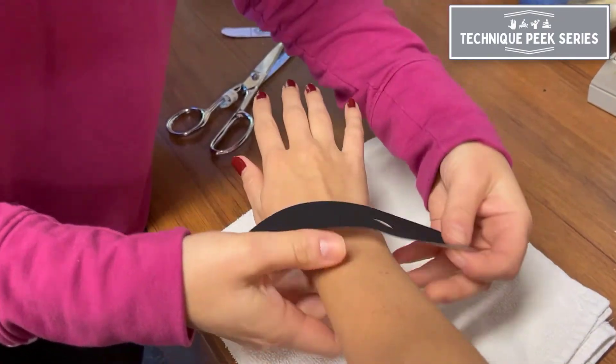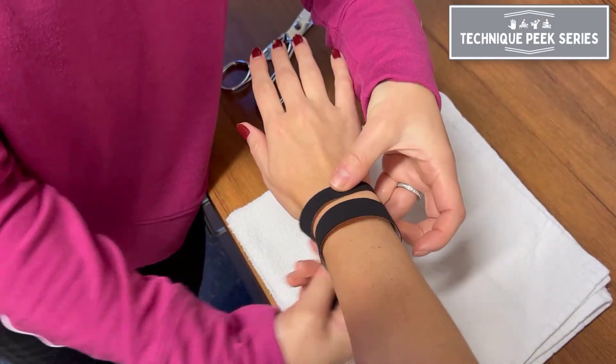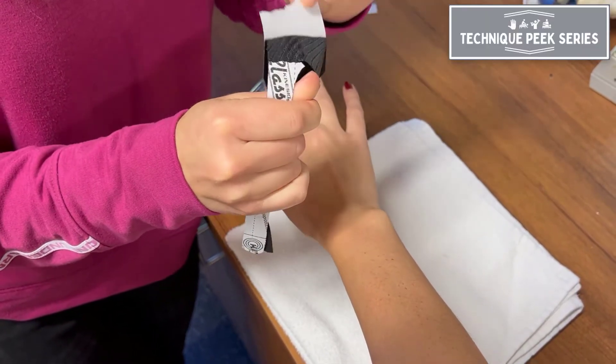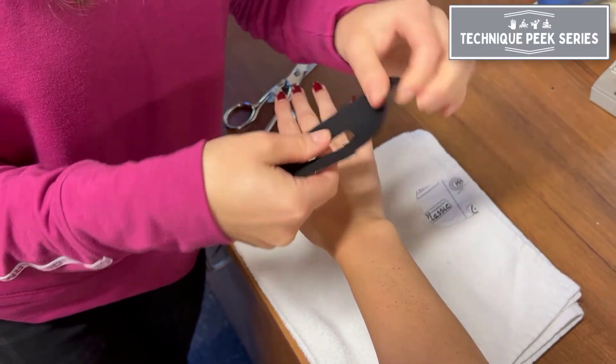The U-shaped opening will allow the ulnar styloid to come through. The tails will wrap around the wrist. Tear each tail and apply the anchor piece with no tension first.